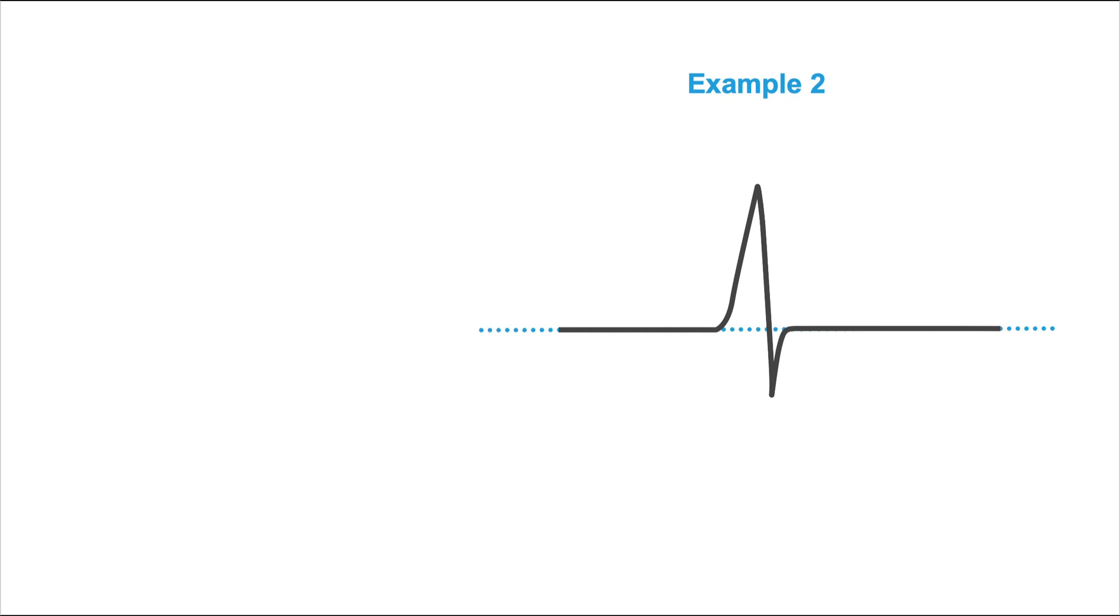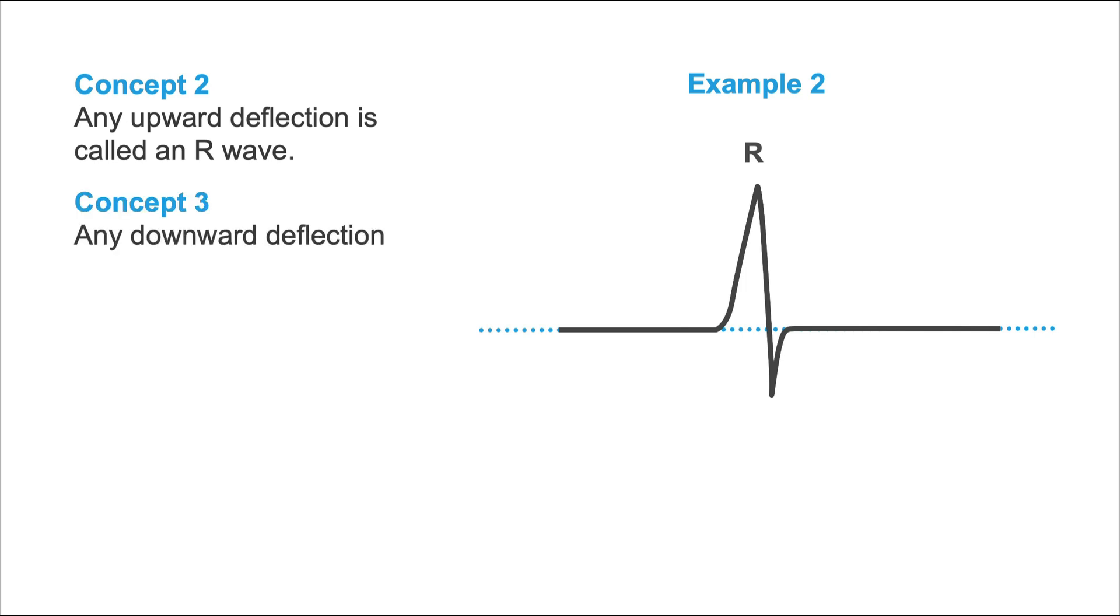Now let's check out example number two. As you can see, we have no initial downward deflection in this case. So according to concept number two, any upward deflection is called an R-wave. So no Q-wave here. And according to concept number three, any downward deflection that comes after an R-wave is called an S-wave. So we have an RS-pattern here.